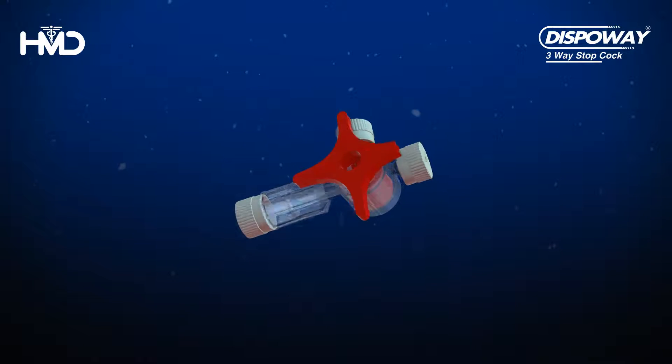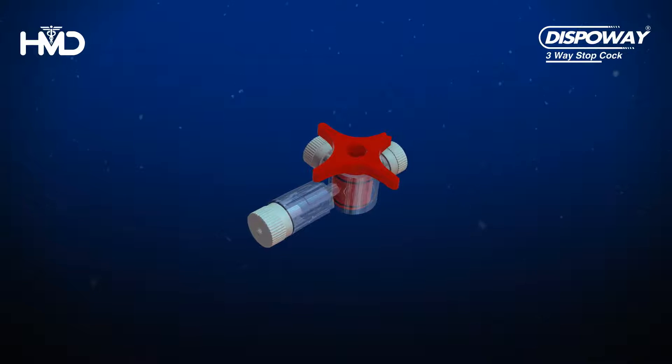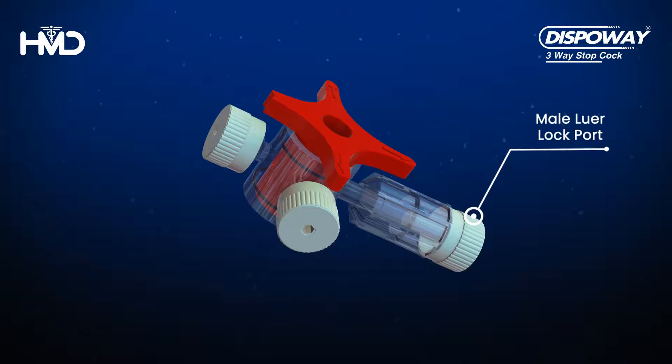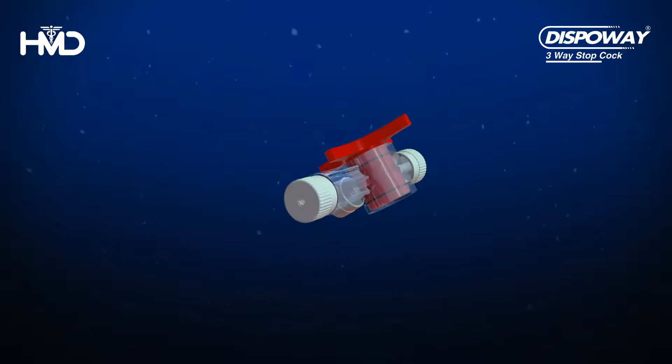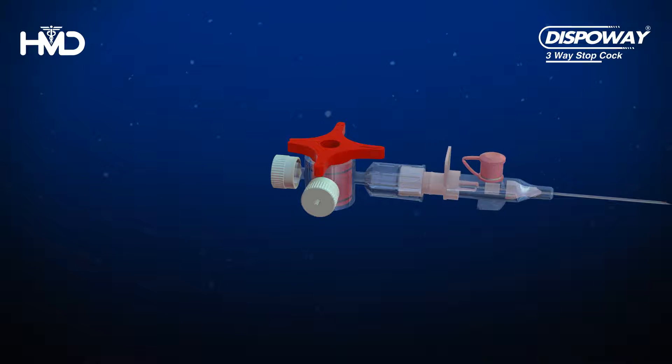DispoWay is a three-way stopcock device used for the transfusion of blood and medicinal fluids. It has one male Lurelock port and two female Lurelock ports. The male Lurelock port connects the infusion device to the stopcock.